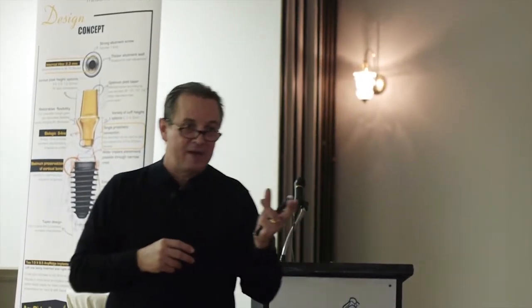So all I'm doing is going into Snagit, snag out the whole smile. Then we extract all the teeth, put all the conditions, snag that, and everything is just layered on top of each other in PowerPoint. And sometimes I won't see a patient for a year or two.